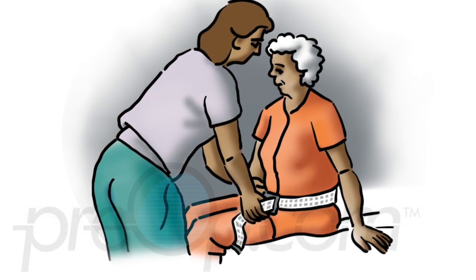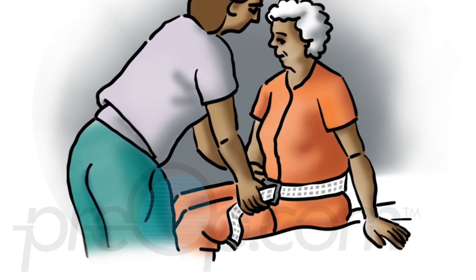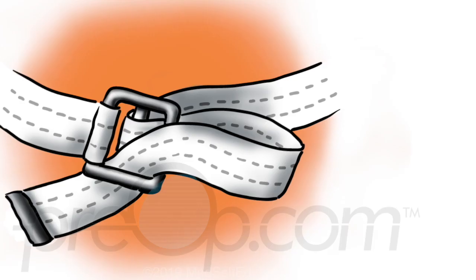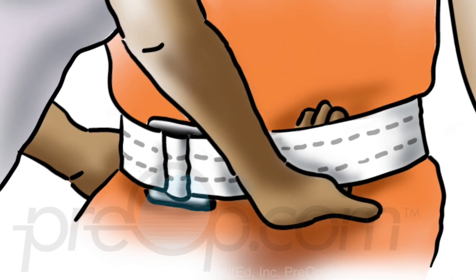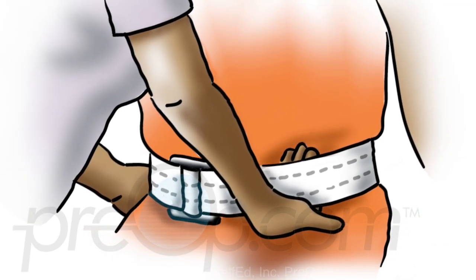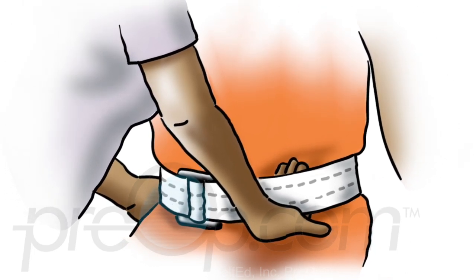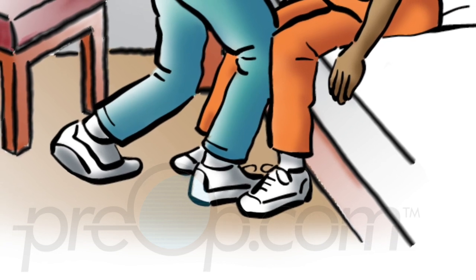Place the transfer belt around the patient's waist with the buckle in front. The belt is always applied over clothing and must never touch the patient's skin. Thread the belt through the buckle teeth-side first, pull it snug, and thread the belt back through the buckle for security. Tuck the loose end into the belt. The belt should be snug with enough space between the belt and the robe for your fingers side by side. Have the patient place both feet on the floor or footstool if necessary.